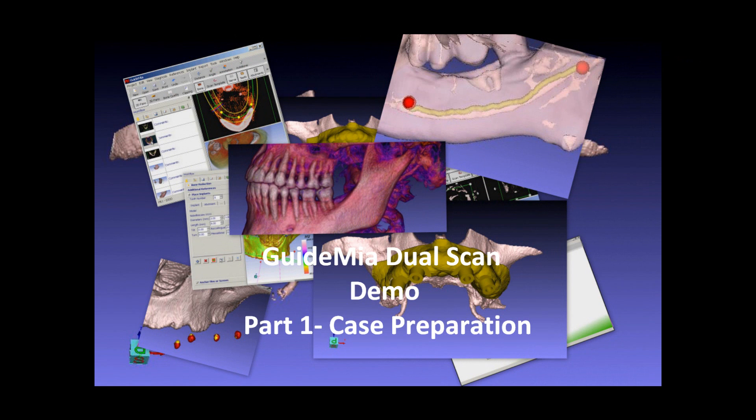Hello everyone. In this short demo, I would like to show you how GuideMia can prepare a dual scan case easily and quickly.